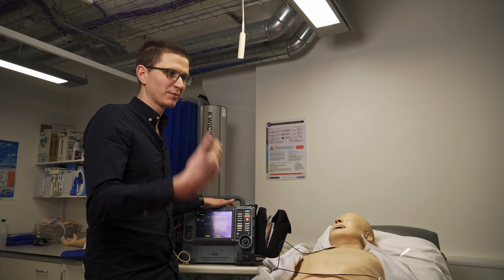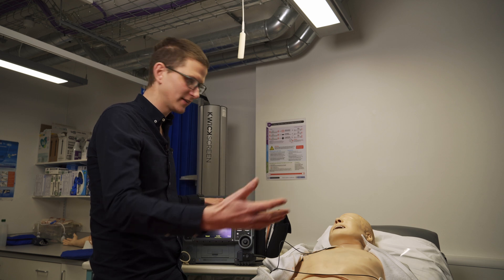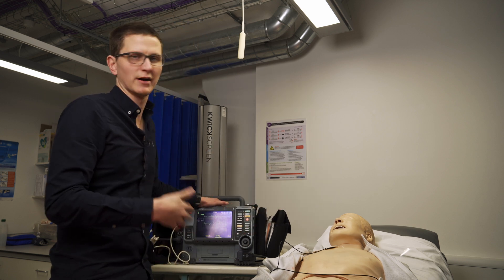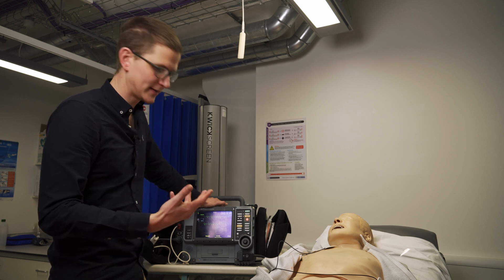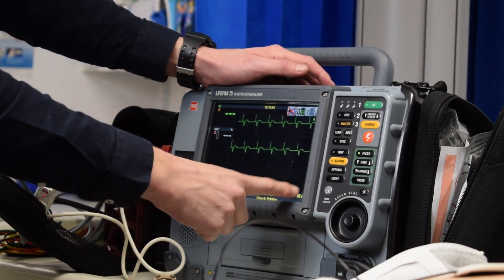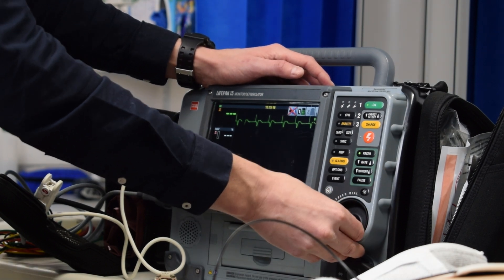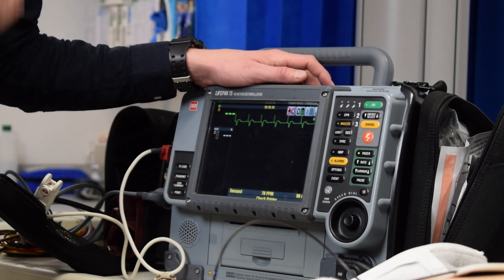We now need to start managing pain and sedation if needed — a little midazolam and some morphine or fentanyl goes a long way. Each trust will have its own protocol for post-pacing pain management. Some places will also say you should build in a 10% safety margin — so if we're pacing at 70 milliamps, bring it up to 77, or practically to 80, to ensure we maintain capture.